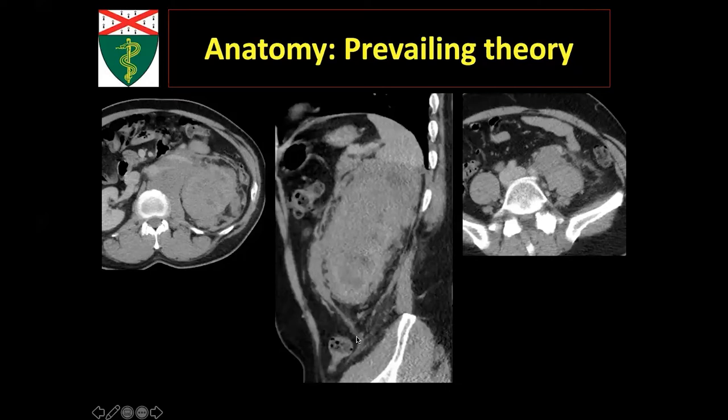Again, you can see on the sagittal image that it's nicely delineated, much thicker within the retromesenteric plane, and it goes down and communicates inferiorly via the combined interfascial plane, which is very, very thickened in this instance. So this is a case of lymphoma of the left kidney that's decompressing through these channels and expanding all these different planes.